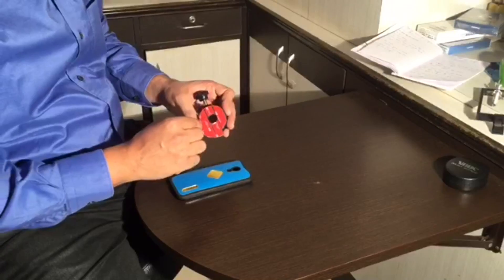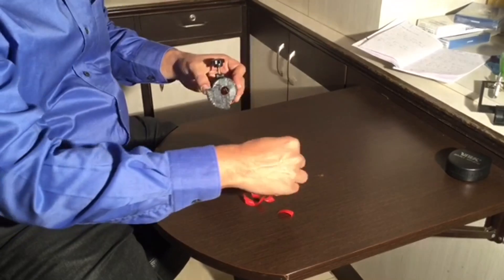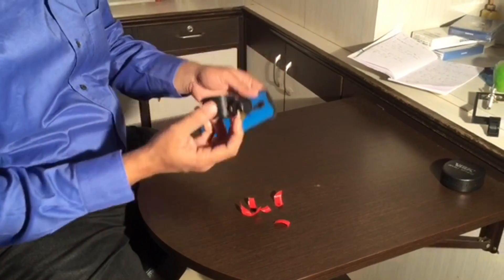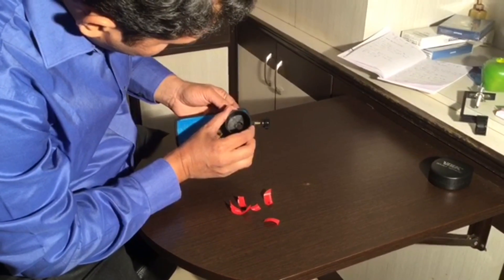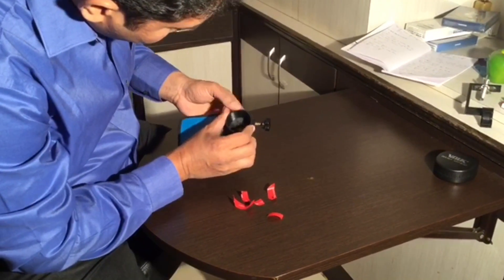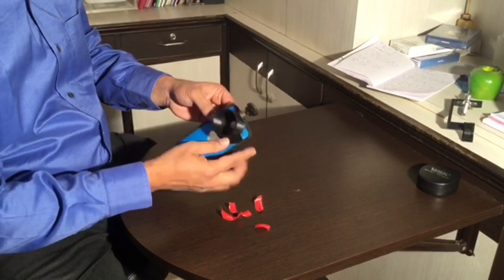Jaisame has a glue sticker on the flat side. Peel off the sticker and stick it to a flexible silicone mobile case. Once glued, it is difficult to remove.